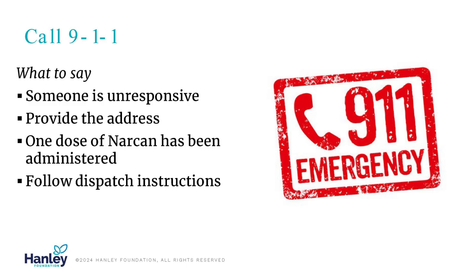So the first thing you want to do is administer the Narcan, and I'm going to show you exactly how to do this in one moment. But as soon as you administer that first dose of Narcan, you also want to call 911 immediately. The most important thing to say is that someone is unresponsive. You want to provide the address of where you're at. If you don't know the address, I always tell people, be aware of your surroundings, and always be aware of cross streets and landmarks that are nearby, so you know where to tell first responders to come.